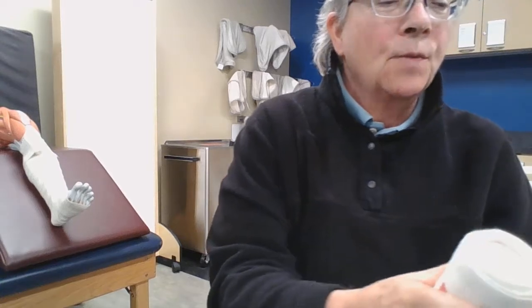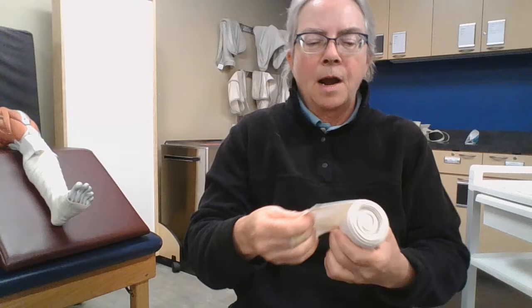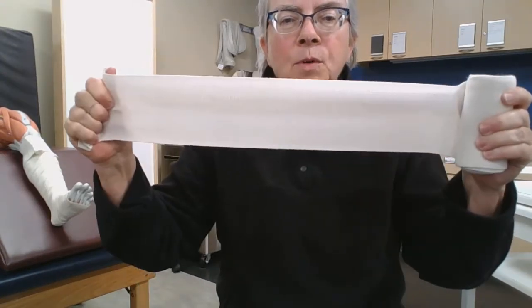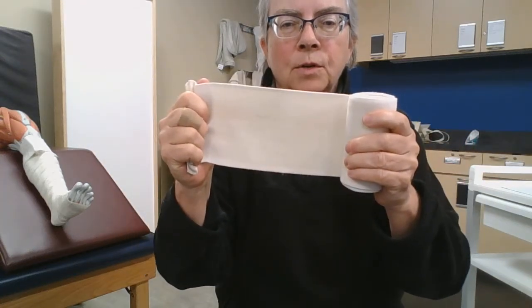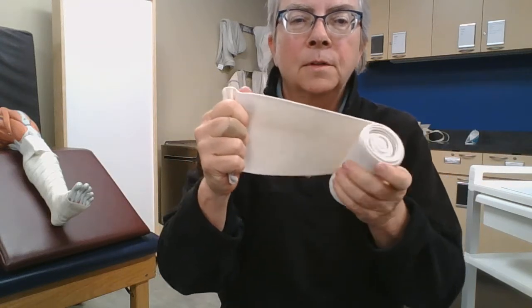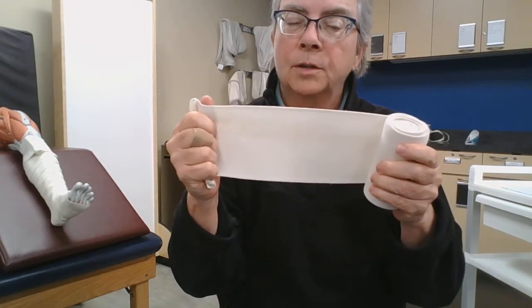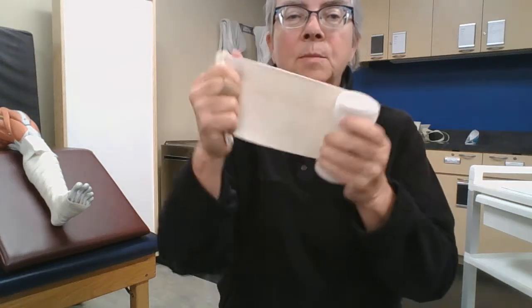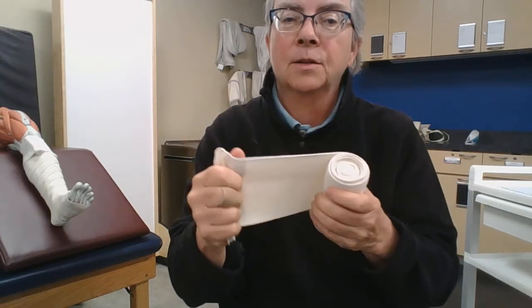We know that ACE wraps are a long stretch compression wrap, right? So when we look at an ACE wrap, we have 100% stretch, about 50% stretch, and then no stretch. So 50, 100, okay? When we're wrapping, we want to be mindful of how much stretch we're putting on. So the more stretch, the more compression, right? Okay, so we've talked about having more compression distally than proximally, so we're going to have a bigger stretch on this, and as we go up, it's going to be less and less, okay?